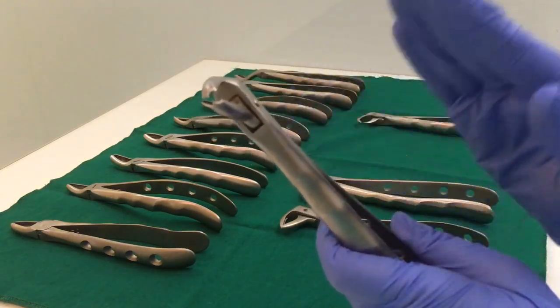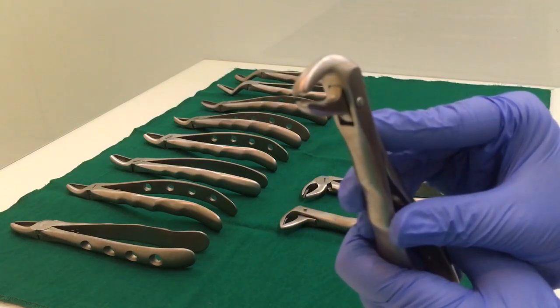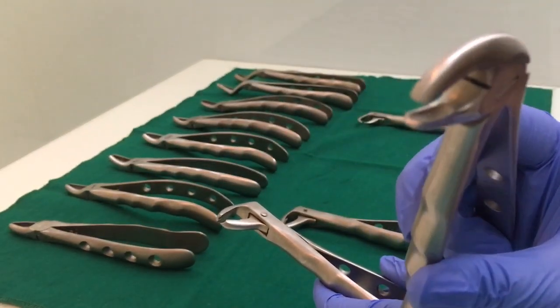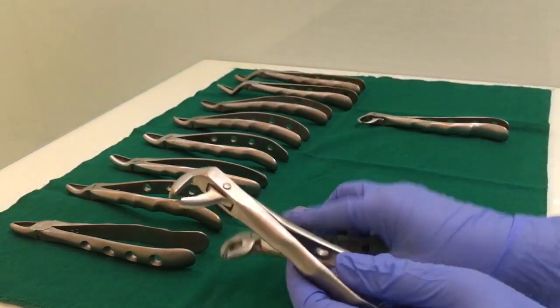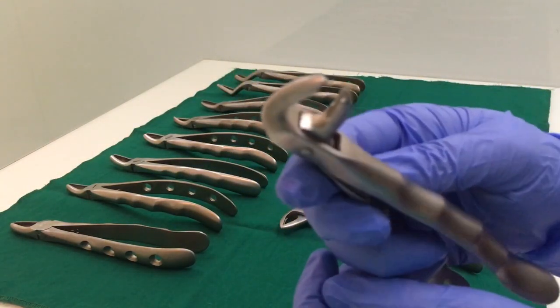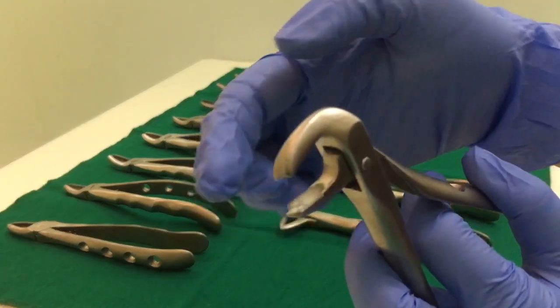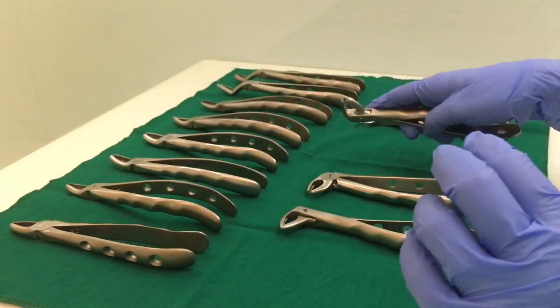This is the lower molar forceps. Again, there is no meeting of the beaks at the end, but the difference between the lower premolar and the lower molar forceps is that in the premolar the beaks are rounded — both of them, no point. Whereas in the lower molar forceps, both beaks are pointed. This makes it your lower molar forceps.